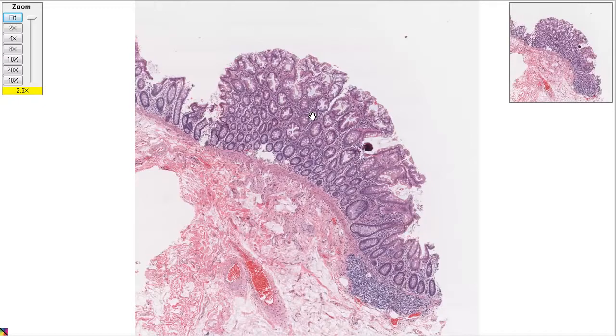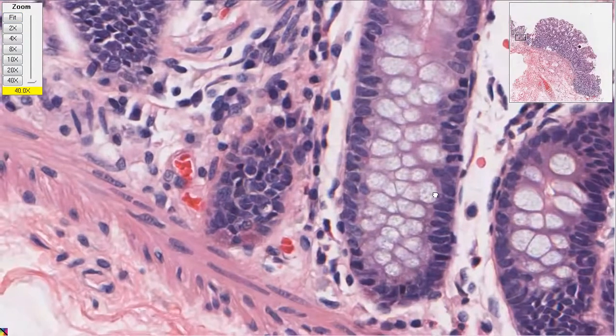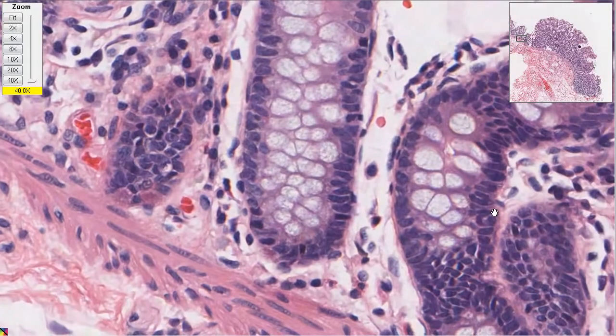So it's possible that it just happened to be when this section of the colon was taken out. If this was done a day later, maybe this might not have been there. Probably it would take longer than that, a couple of weeks. What happens is that the cells come from the bottom and they work their way up towards the top, and so eventually the top would behave. It's kind of like the skin: these cells are constantly being used up because things are scraping by them.